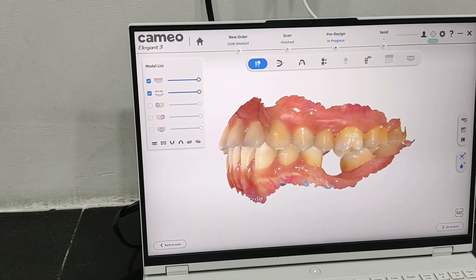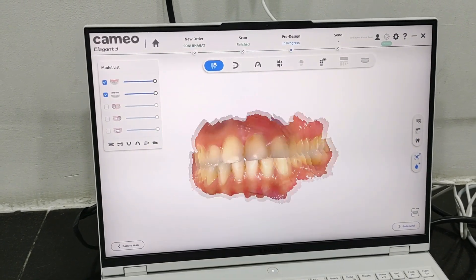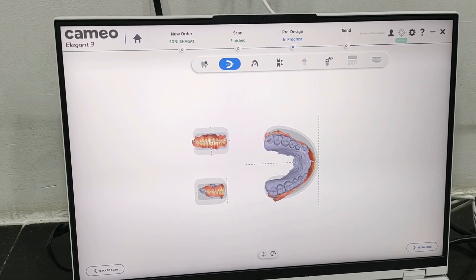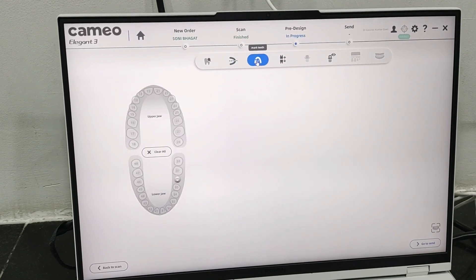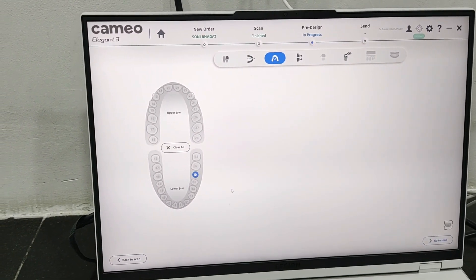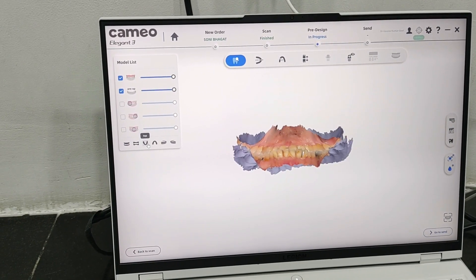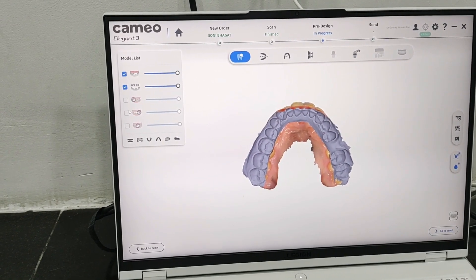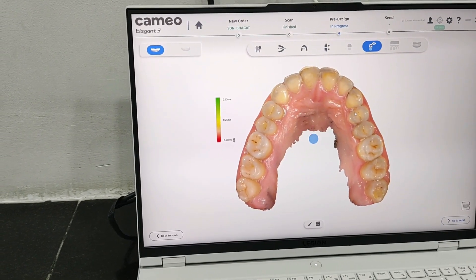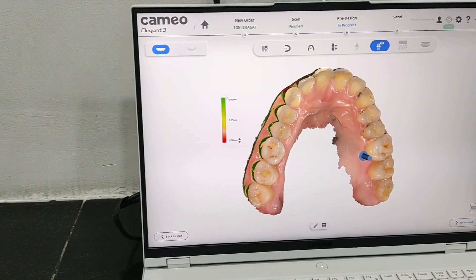You can see the upper scan — it is a nice color rendering that is happening. You can adjust the model and mark the tooth — like this has been marked for implant at 36. You can see the bite scans. You can even see the undercuts with this — it can show you the undercuts. You can measure at which point how much undercut is there. This is the marking of undercuts.